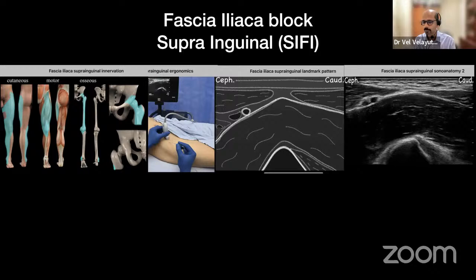And these two muscles on either side, the one at the front towards the head end is the internal oblique, towards the bottom end is sartorius. And you see the two vessels, femoral artery and vein. Sorry, not femoral artery. It's the deep circumflex iliac artery and vein.